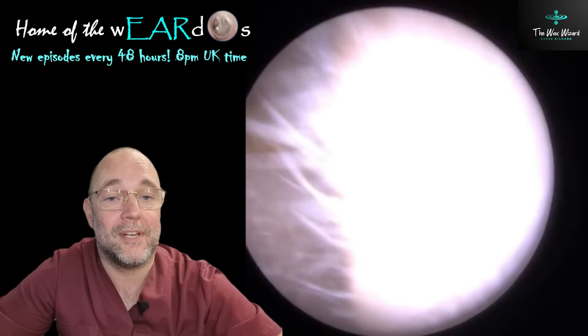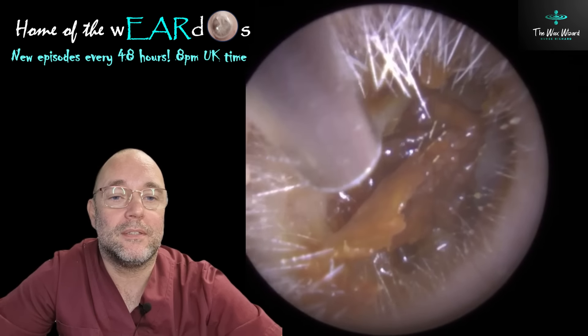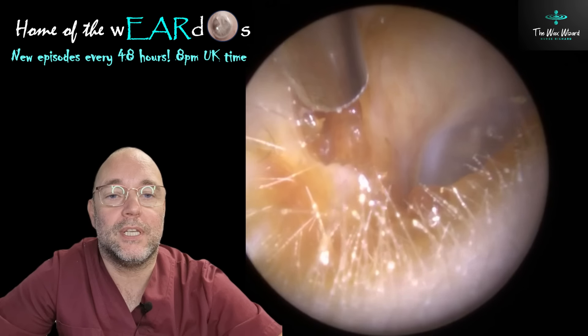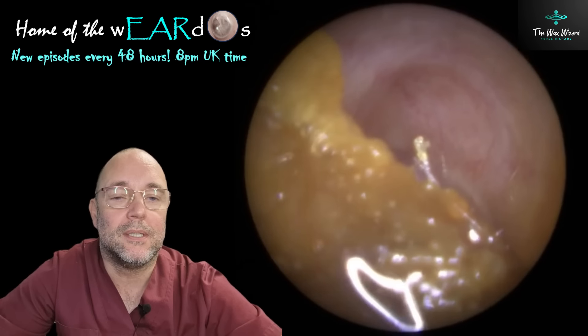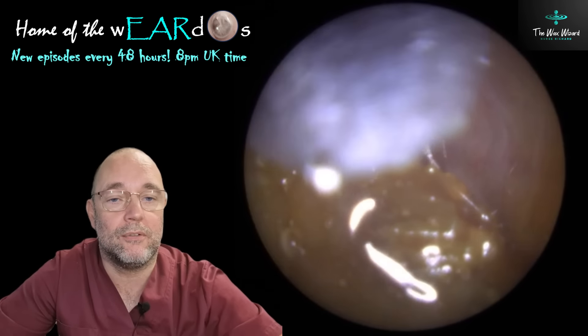This is the one that she hadn't poked her finger in. It's quite soft and wet. This one's too difficult to get out — they just make a jump back because of that little scoop. A little bit there left, not really too significant, but let's just get that one little bit. It's always a good idea to leave a few little smears around the outside — healthy for you, having a bit of earwax in there. The natural oils lubricate your ear.